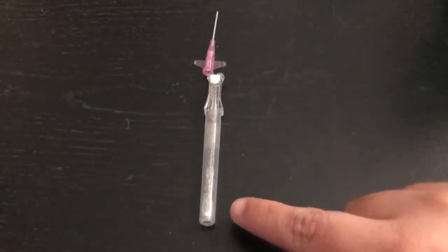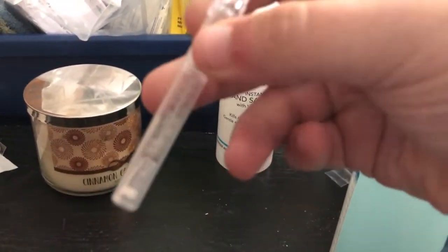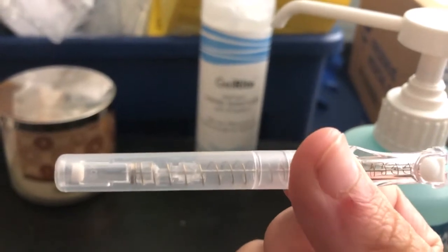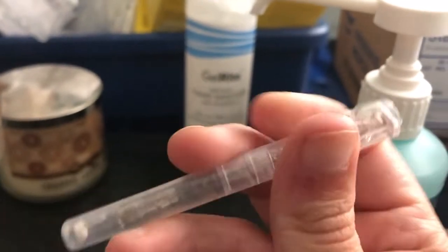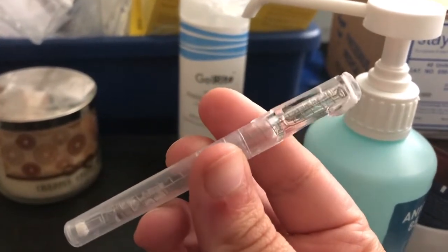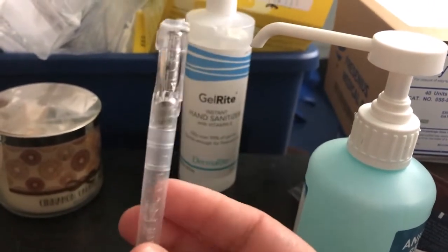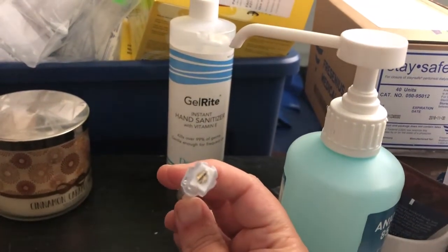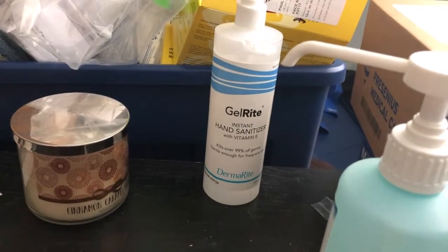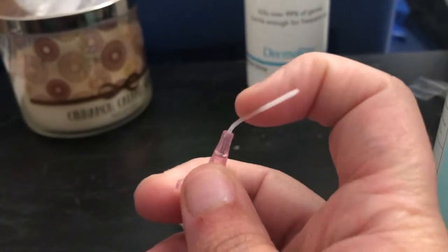Did you see how that just shot down? And this came out. So the needle is actually in here. Now you can see it's not clear anymore. The needle is in there and you can see it pretty well. It's like spring loaded. The spring goes all the way down. And you can see the needle is right there. Now this is no longer a needle. This is actually the IV catheter.